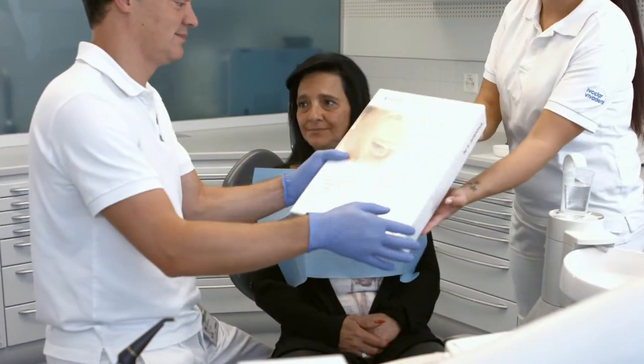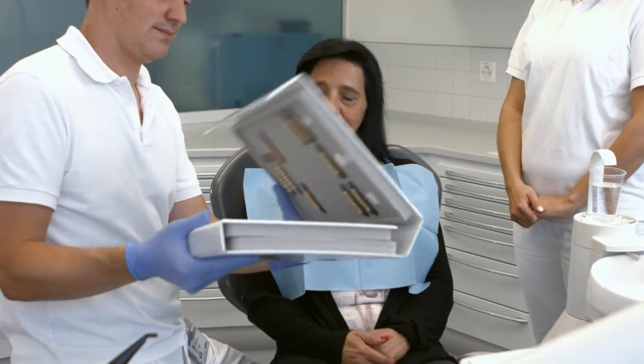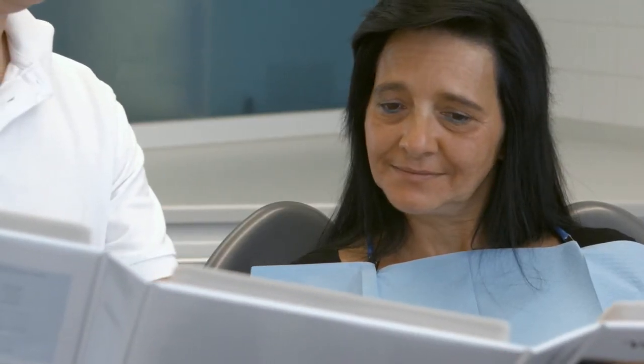After you have taken a functional impression and bite registration, select the desired tooth shade and shape in consultation with your patient. Discuss distinctive anatomical features and personal preferences with your patient.